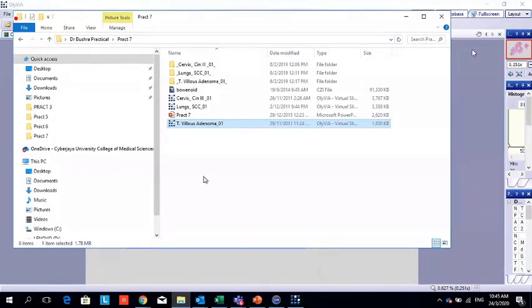Alright. Fourth case is a 49-year-old man presented with a history of persistent cough for 6 months despite a few courses of antibiotics. Lately, he developed hemoptysis. He has been smoking cigarettes since he was a teenager. Repeated chest X-ray showed features suggestive of pneumonia. Look at the microscopic slide from the specimen and describe your findings.